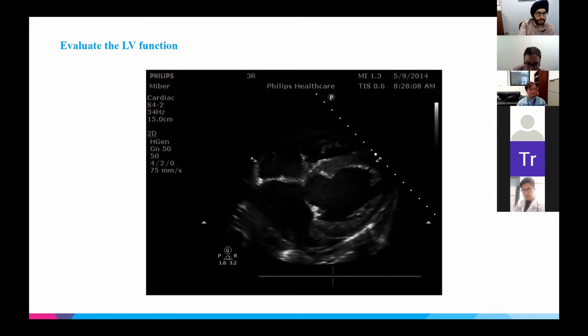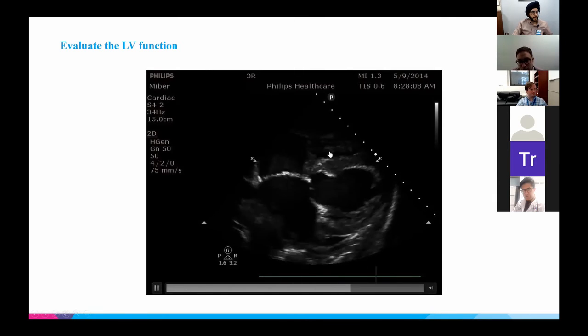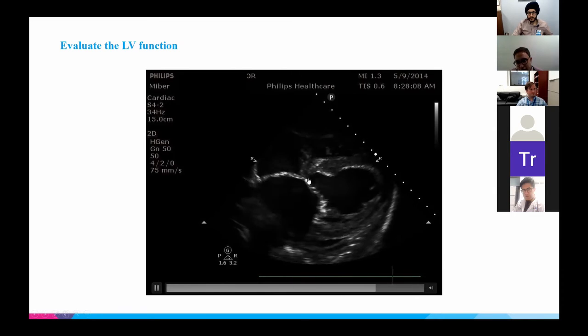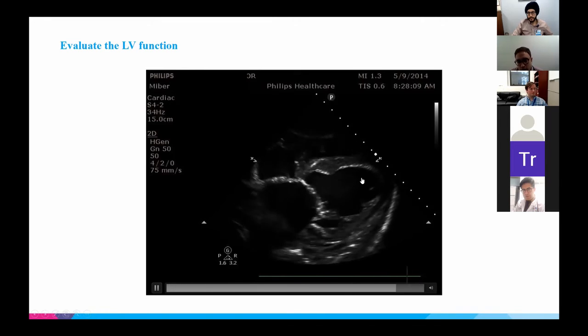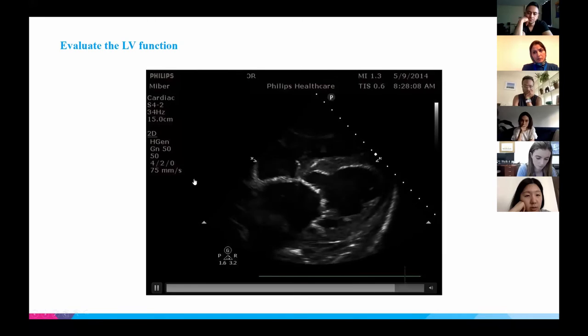Yeah. So I think, obviously you were correctly able to determine that something was not normal, right? So again, the question is whether you think the walls are contracting at least a little bit or really not much at all. And I would say in general, if you look, you can see the cavity fairly clearly here, and the septal wall is delineated, and there's not much change at all in the cavity with contraction. So this is someone who I would classify as severely reduced.